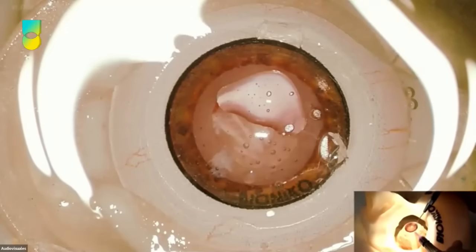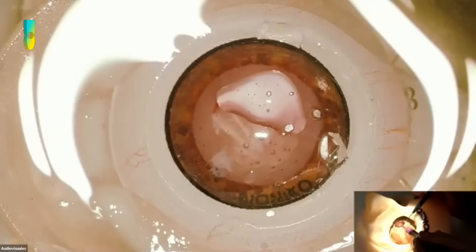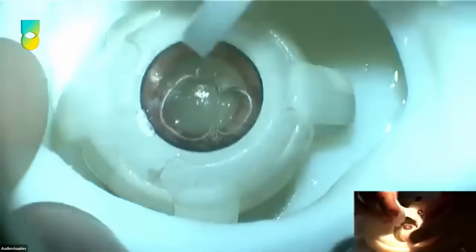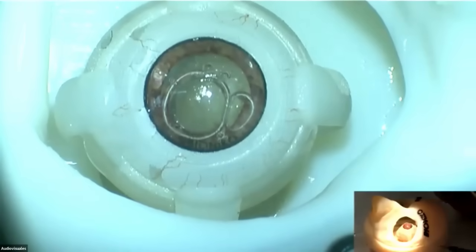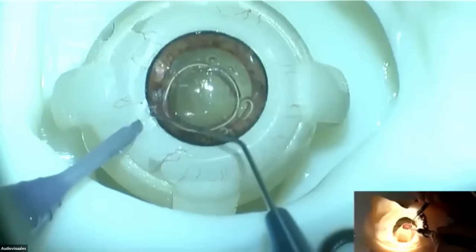When I was a resident, we didn't have bionic eyes. We didn't have phaco machines only for learning. We had to stay after the operating room closed. We took pig's eyes and used alcohol with an injection into the lens, and that is how you make the cataract.